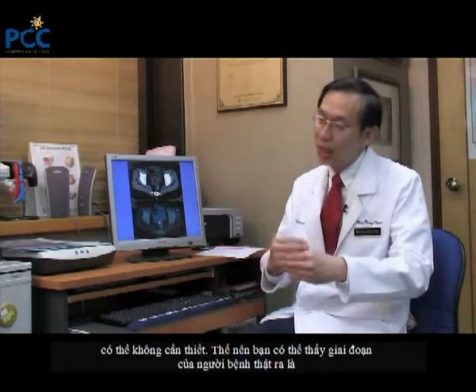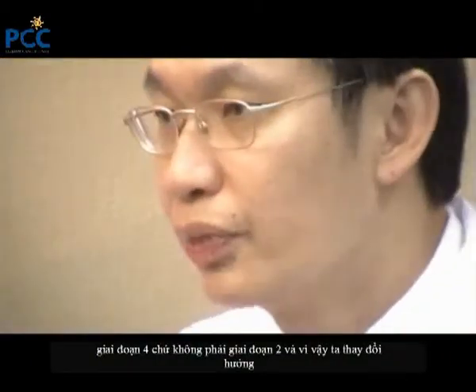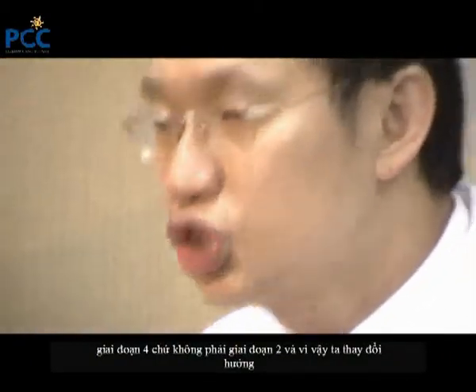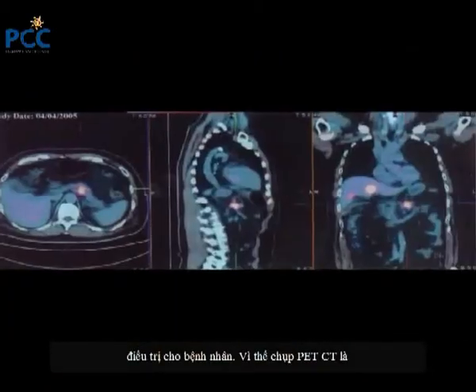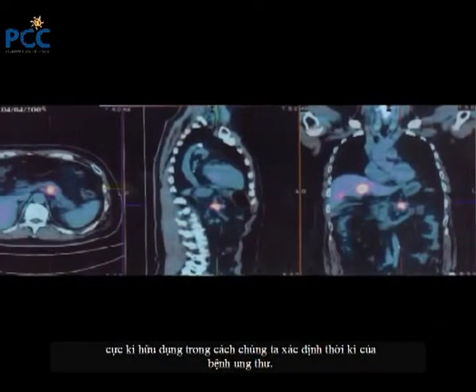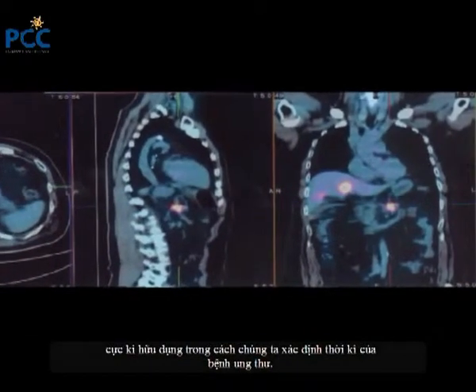You may actually upstage a patient from a stage 2 to a stage 4 and thereby, change the way in which you're going to manage this patient. So a PET CT is extremely useful in helping us to stage the cancers.